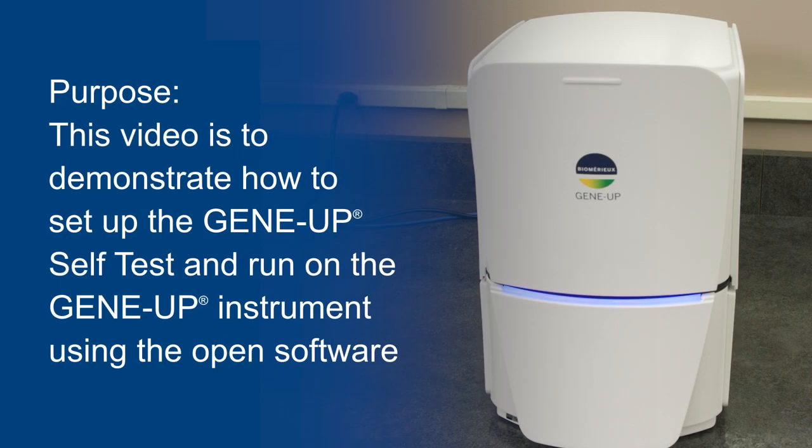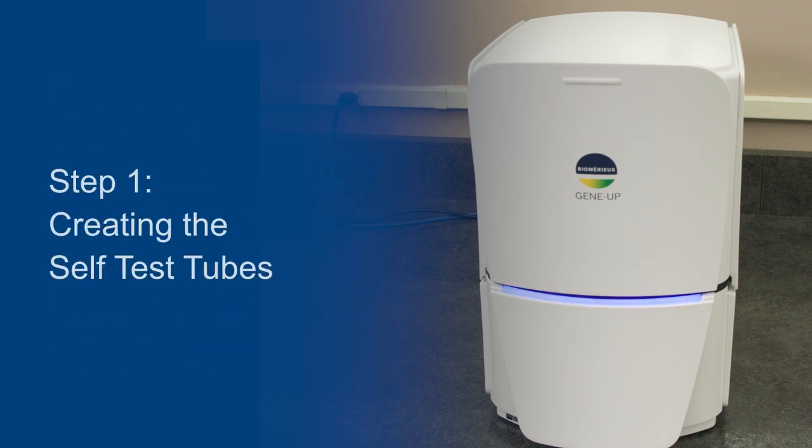Welcome to this video where we will demonstrate the setup of the GeneUp self-test and run on the GeneUp instrument using the open software.